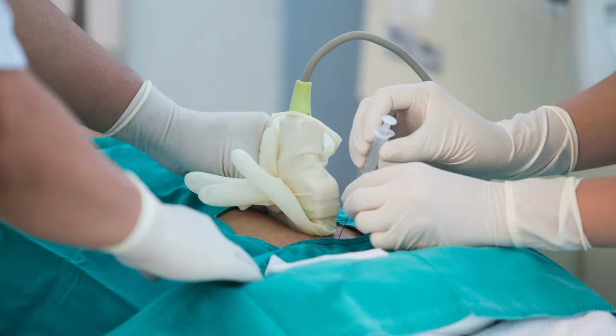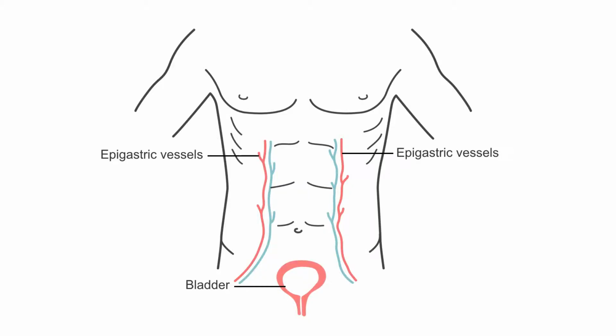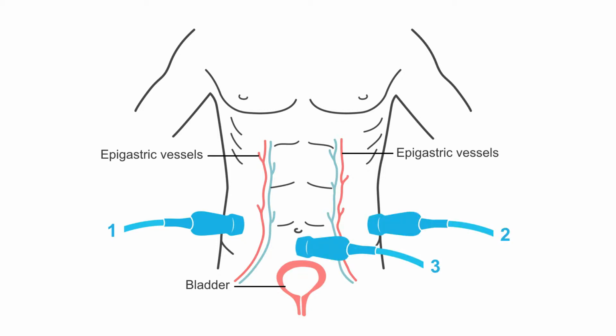For me, there are a few major advantages of using ultrasound to guide your paracentesis. Number 1, location. If I plan on doing this procedure, I can look at multiple different locations to figure out which is the optimal choice. Where is the most fluid? Where are there no bowel structures or vessels, especially the inferior epigastric vessels, which you'll want to identify using ultrasound prior to performing your procedure. Traditionally, there are 3 locations that you can pick from: the right lateral gutter, the left lateral gutter, or midline by your linea alba.